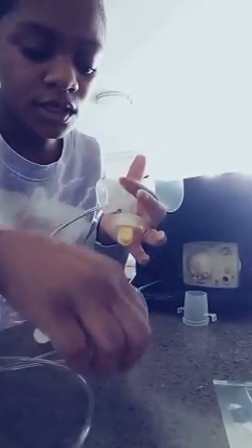So I'm going to connect the other side just like I did for the last. Insert the tubing. Connect the tubing to the pump.